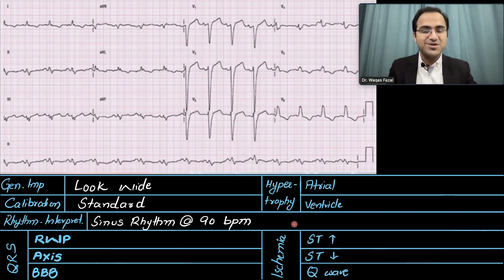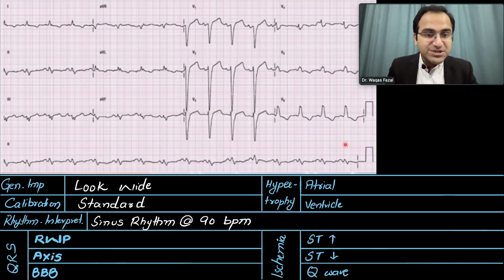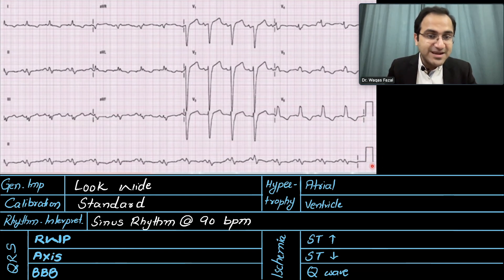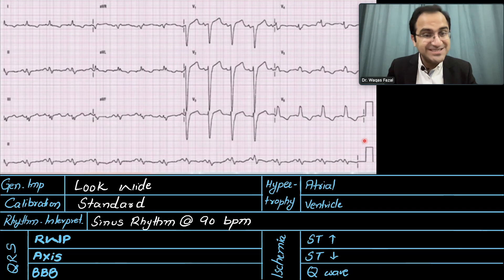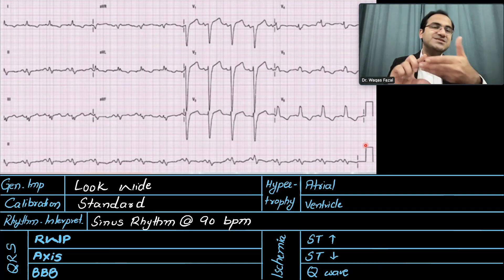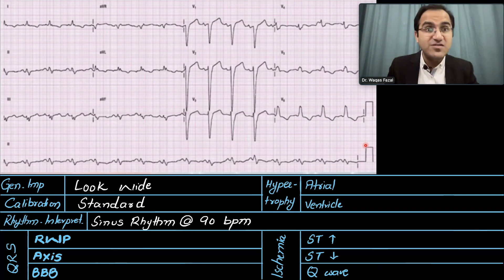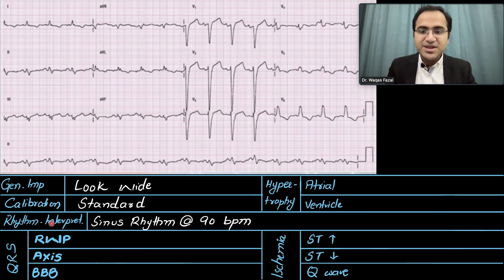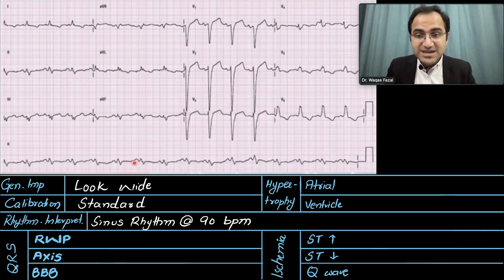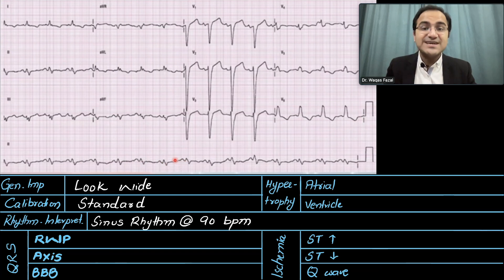Looking at the calibration: a normal standard calibration box should be 2 large boxes tall and 1 large box wide. This is a standard calibration, meaning the ECG machine is printing at 25 mm per second. Looking at the rhythm: P waves are present and are followed by QRS complexes, so this is a sinus rhythm.